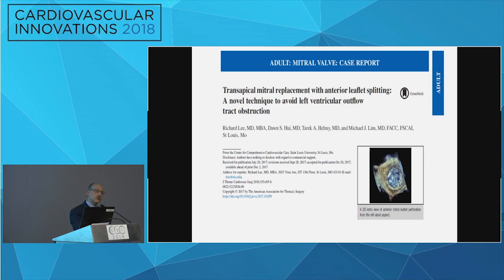And then when you get in the anterior leaflet, in one case we were actually too basal, too close to the annulus. So we had to withdraw and move a little anteriorly. It's not 100%. Again, with the LAMPOON, you see the diagrams and the images, it's not 100%. You get close enough to where you actually have purchase on the valve leaflet, and then you perform your procedure. The concept and purpose here is to minimize LVOT obstruction. It's not plastic surgery, so you want to get a good result.